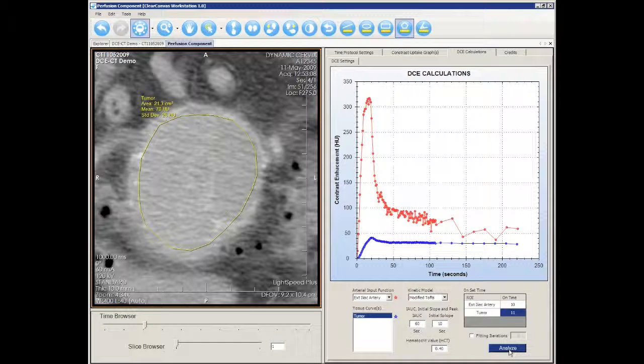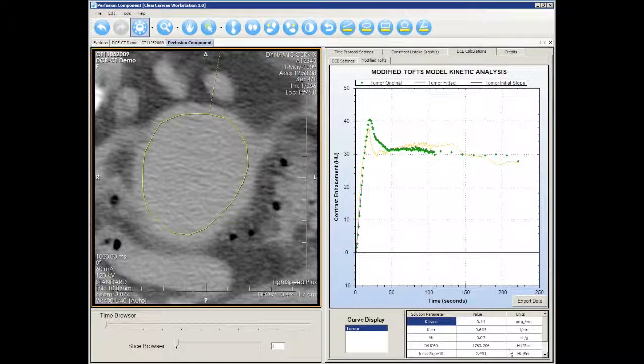Click Analyze. This screen shows the results of the analysis. The graph shows the measured contrast uptake curve of the tumor and the contrast uptake curve of the tumor fitted using the modified TOFTs model.